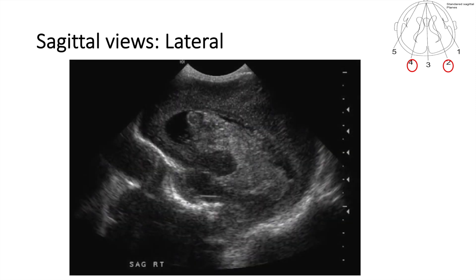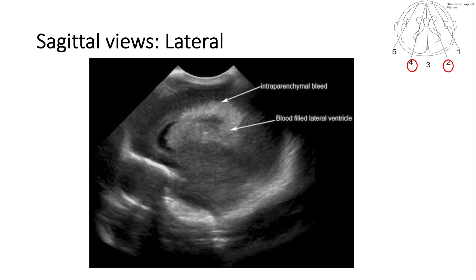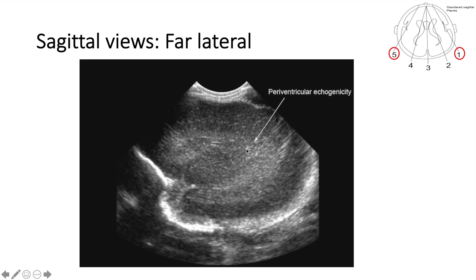When there is too much blood filling most of the ventricle, or if there is dilation in the ventricle, this is grade three IVH. Furthermore, when there is intraparenchymal bleed, this is what we call grade four IVH.